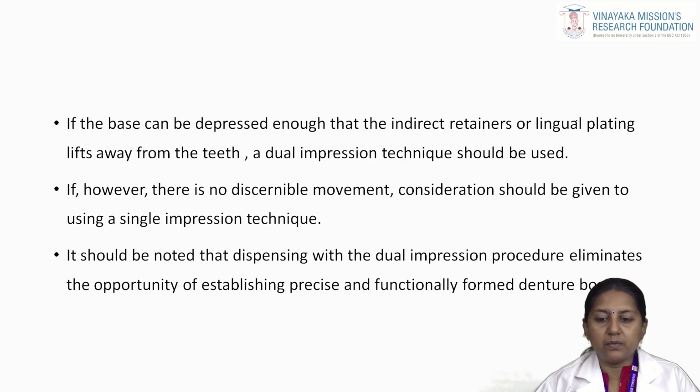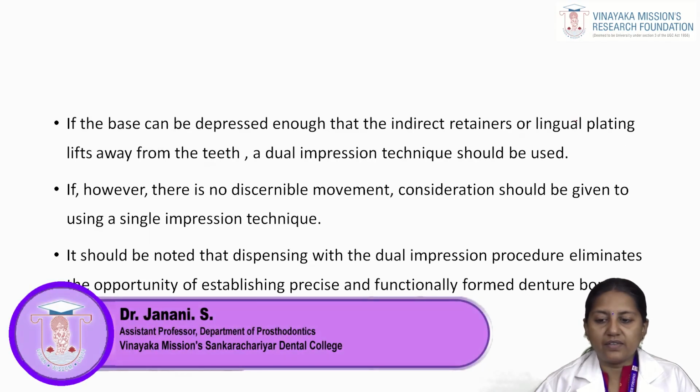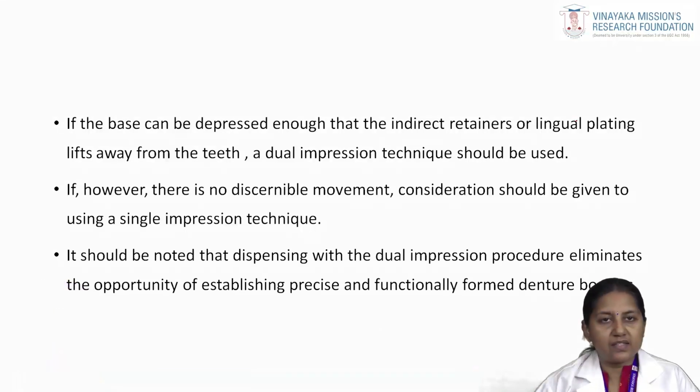If the base can be depressed enough that the indirect retainers or lingual plating lifts away from the teeth, that means a dual impression technique should be used. But if there is no discernible movement, consideration should be given to a single impression technique. It should be noted that dispensing with the dual impression procedure eliminates the opportunity of establishing precise and functionally formed denture borders.